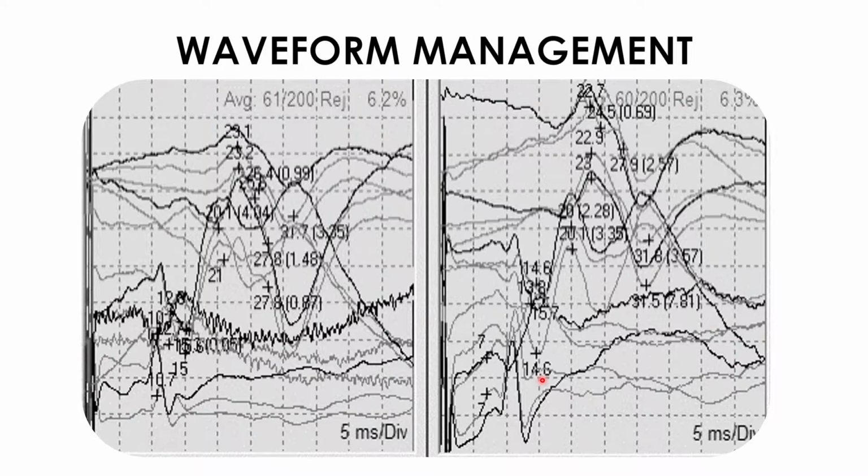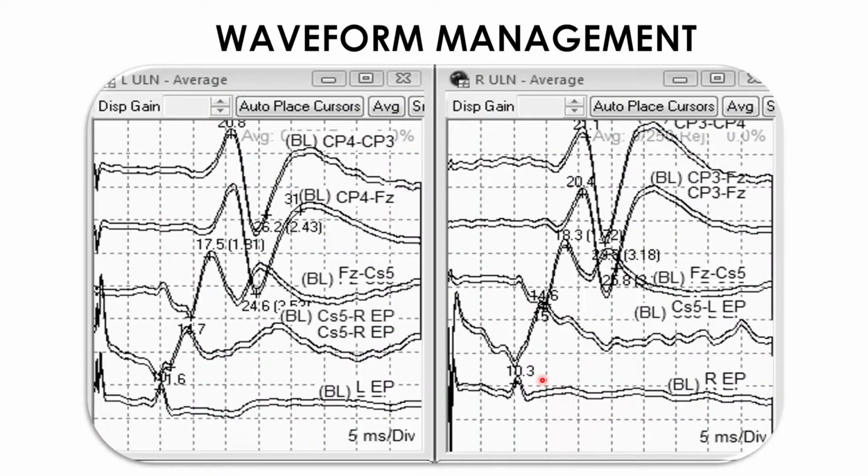This is an actual case that I had to look in on. I'm not sure how you can determine if a change occurred or not by looking at this. Much better. Make sure you can identify each waveform channel by channel. The labels are out of the way. You can clearly see what you need to see. And your remote supervisors can quickly help you should you need any help technically. The remote professional interpreters also appreciate this. This allows for fast interpretation of data.